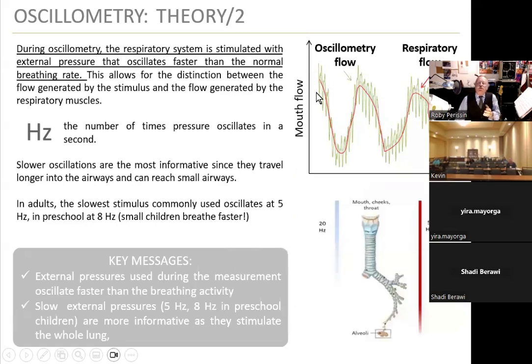So during oscillometry, this is what happens when the patient breathes, or what you will be able to do with Alvin Zarazua at the end of the session, who has a device there. You will hear a gentle pressure overlaid to your normal tidal breathing. And that's all that happens. And you explain to the patient that the test is very simple, and he probably will believe you, even if the previous time he came, you told him the same thing, and he found himself in a body box with you shouting, blah, blah, blah.